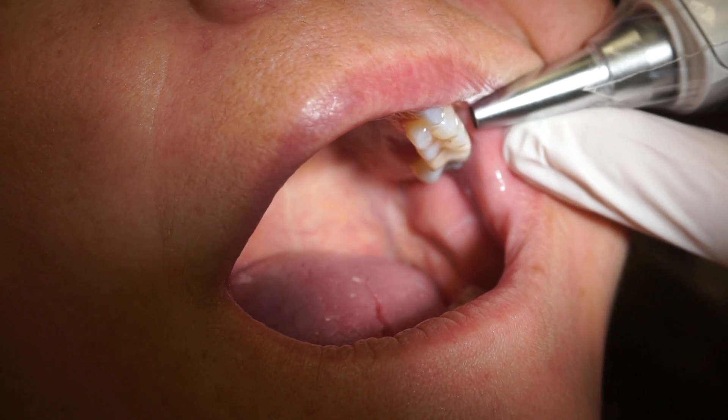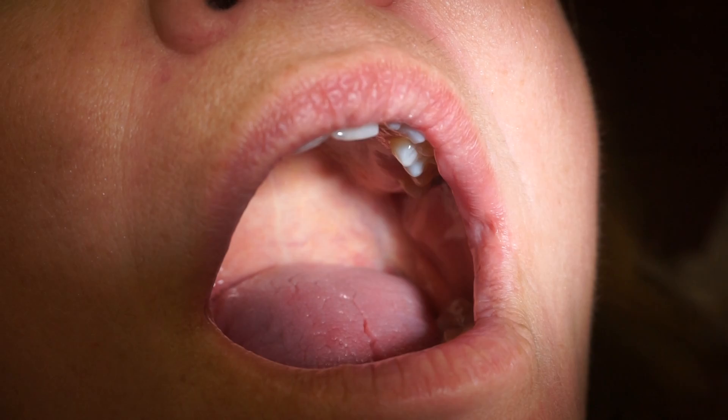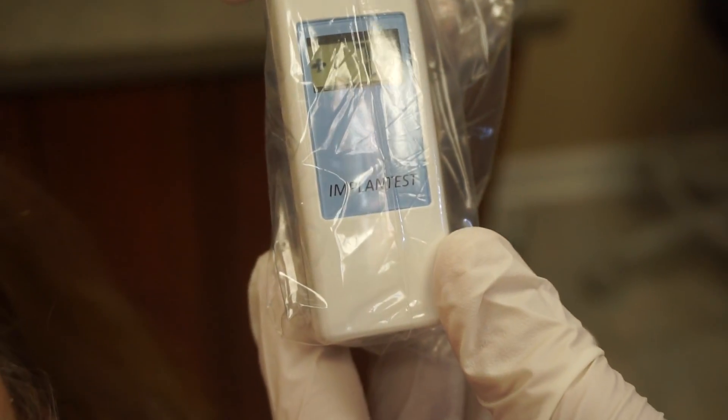And it's very simple, just push the button. You can see the reading is 7.4.